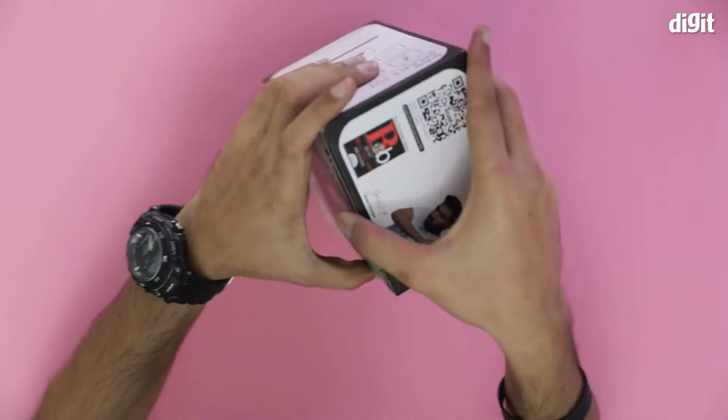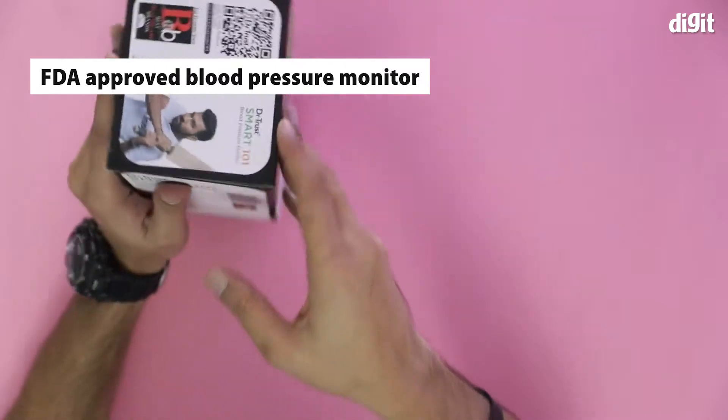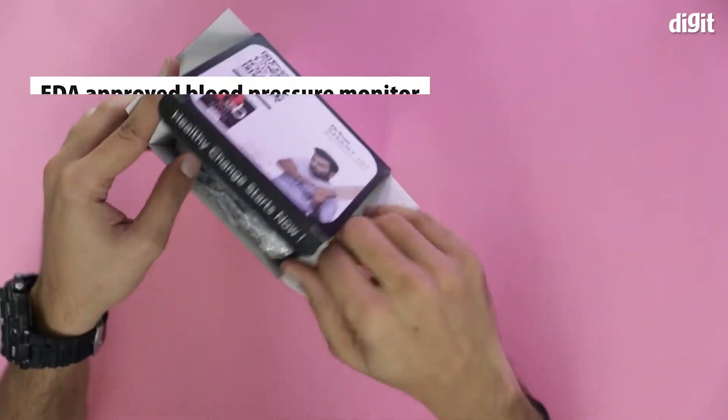Let's just open it and see what the blood pressure monitor actually looks like. Very importantly, it is FDA approved. So that's important.